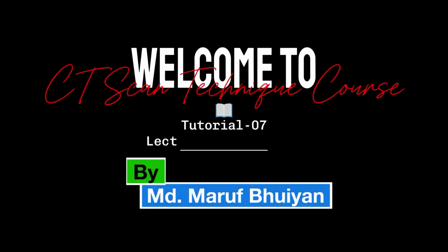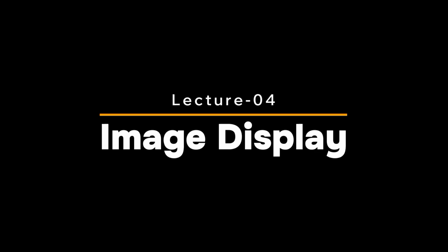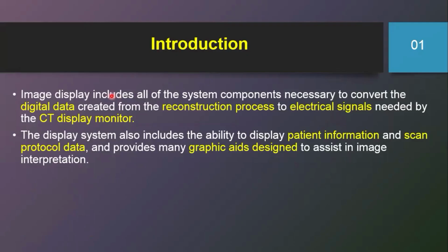Image display includes all of the system components necessary to convert the digital data created from the reconstruction process to electrical signals needed by the CT display monitor. The image display system includes the ability to display patient information and scan protocol data.